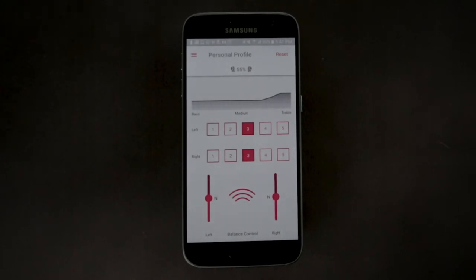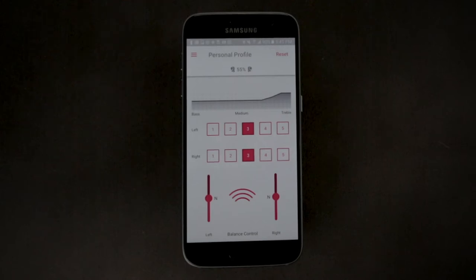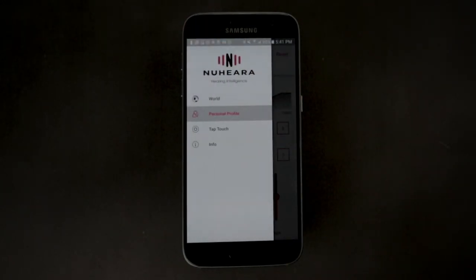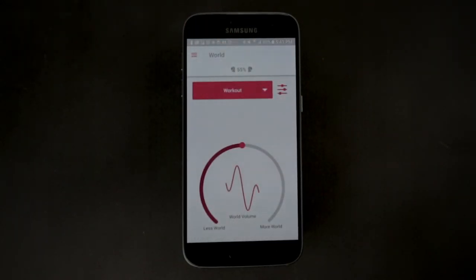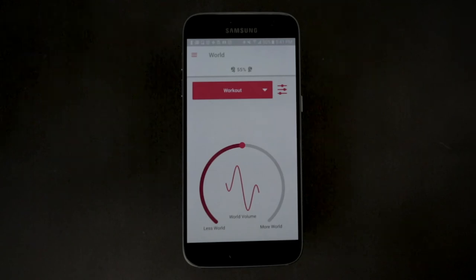If you have selected frequency band setting two, four, or five, or have the balance control set to maximum, then it is important not to set the real-world volume too high as it might result in acoustic feedback when touching or removing the IQbuds. Generally, it should not be necessary to set the real-world volume to more than 75% of maximum.